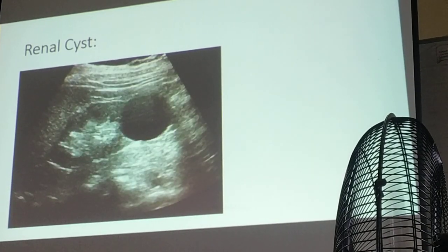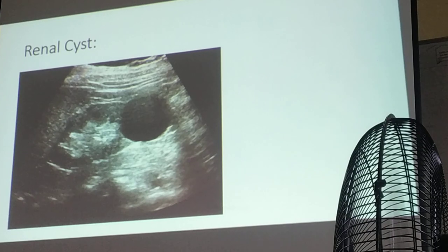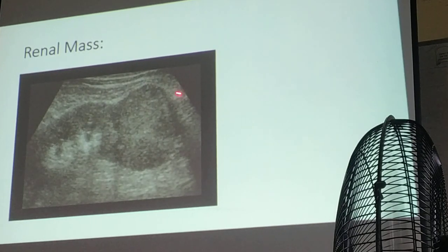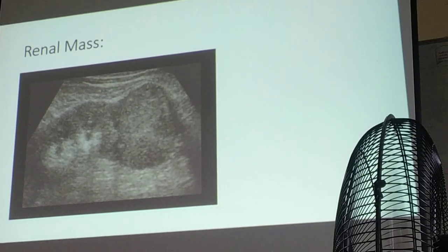It will be fine. This one. So, this is your kidney. So, this is simple renal cyst. Again, this is no longer fluid, more of solid, so this is a renal mass.